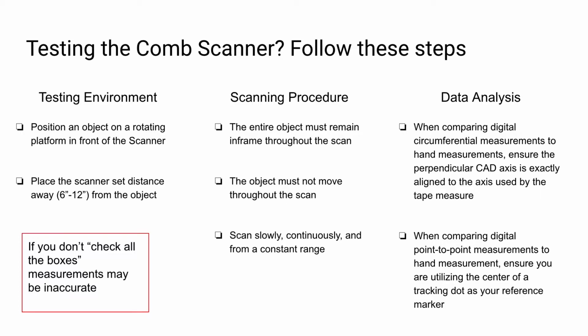Next, the scanning procedure. The entire object must remain in frame throughout the scan. The object must not move throughout the scan, and you must scan slowly, continuously, and from a constant range.